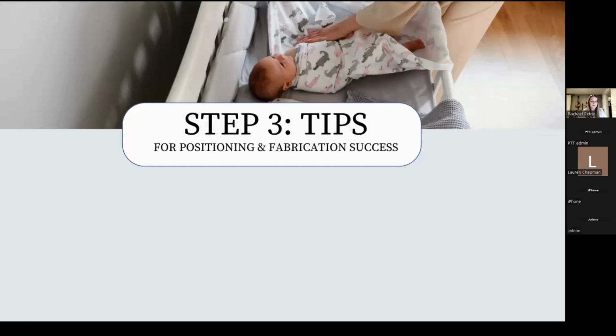Okay, so step 1, we decide what we're going to make. If we need to make anything, we get our doctor's order. Step 2, we decide what sort of heat source we're going to use, and we get all of our materials ready and out, so that we're not having to guess anything else.